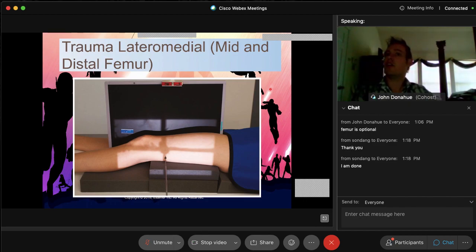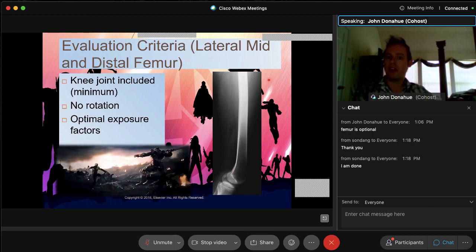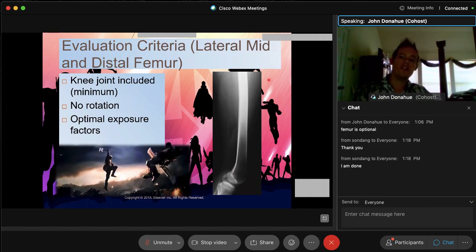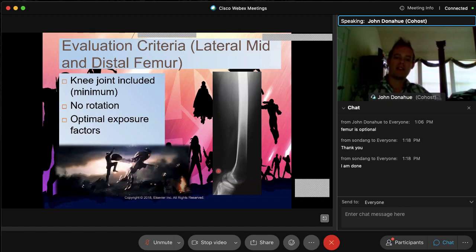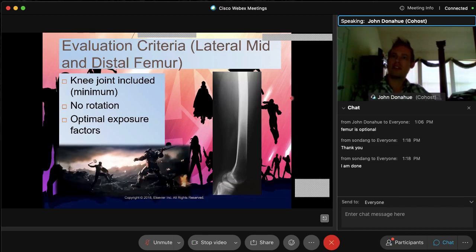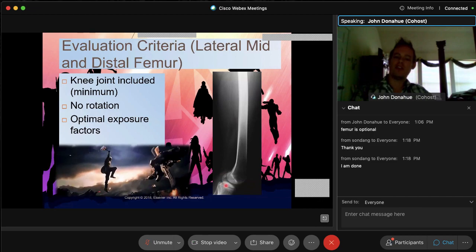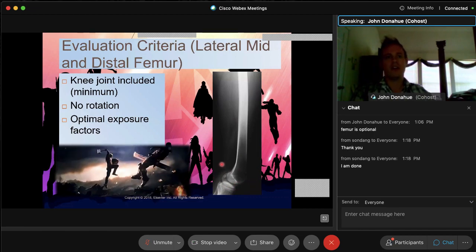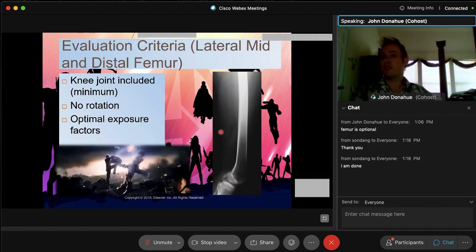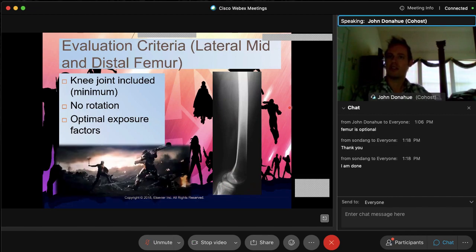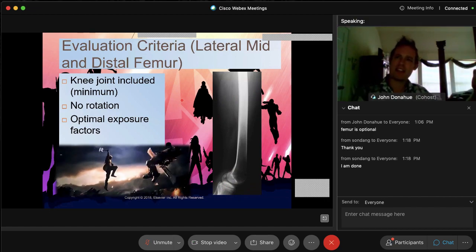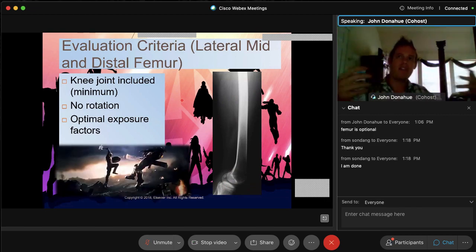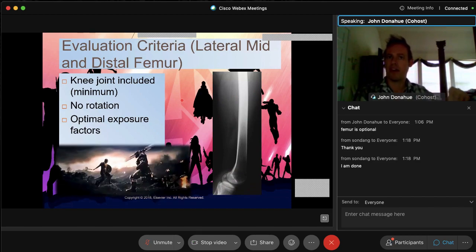So what's our evaluation criteria? Very simple once again. We, of course, do need the knee joint included at minimum. It must be on there, otherwise we have to do a dedicated knee film. No rotation. We do want a true lateral and optimal exposure factors. Now, this image here on the right, this, in my opinion, has a little bit too much rotation, and that's why I suggest to you bringing that unaffected leg over the affected leg for a lateral. If you do that, more often than not, you're going to get true superimposition of those femoral condyles. It's going to give you a much prettier image. So once again, both methods are acceptable. If you want the really pretty images, bring that unaffected leg over the affected leg for those lateral lower femurs. It's going to give you a better image of that knee overall. The same thing I said before, guys, once again, make sure you have that tight collimation horizontally, leaving it open vertically to create that overlap for the radiologist between the upper and lower portions of that femur.